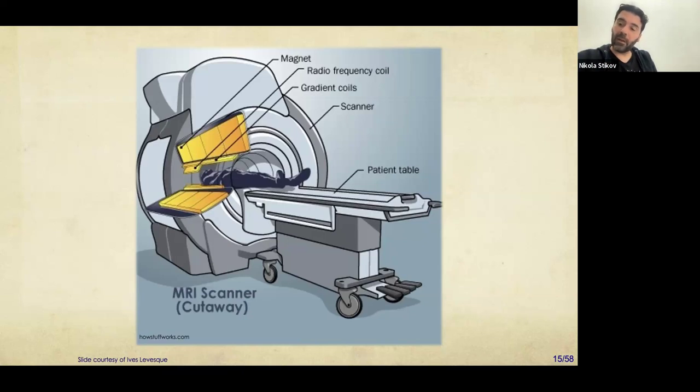Turns out that there's been huge talk about superconduction at room temperature. And a year ago, we thought that, oh, now we actually have that superconductor at room temperature. Turns out it didn't really replicate. It was not a good result. But you can imagine what that will do to medical imaging if we could get superconductors at room temperature. The way they are now, these scanners are expensive.